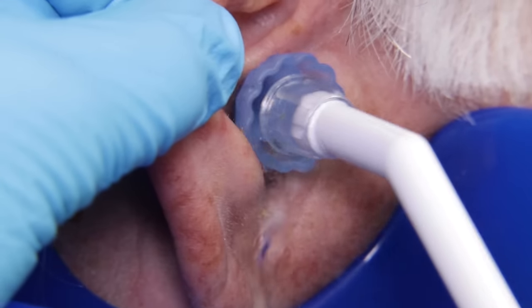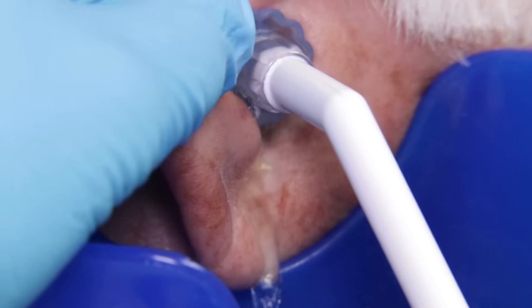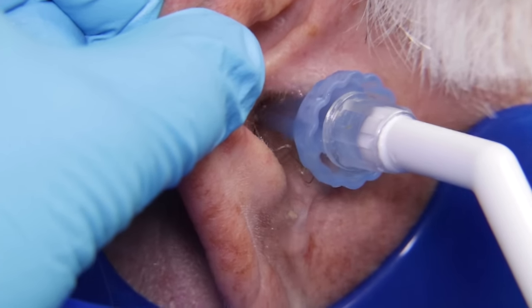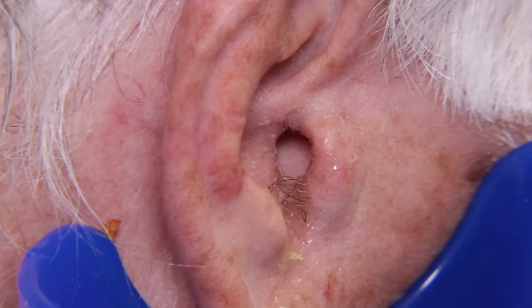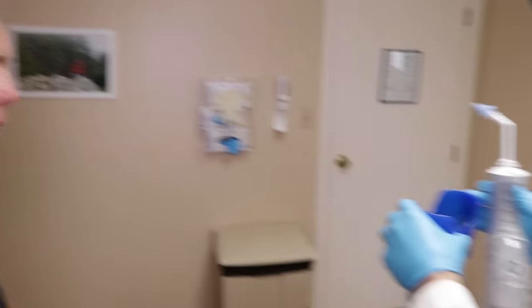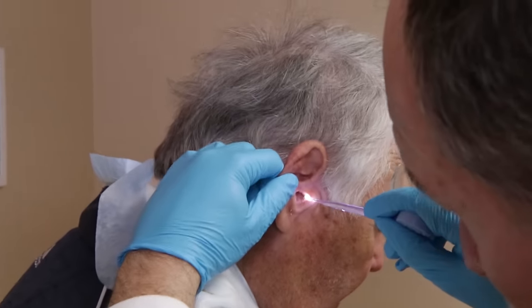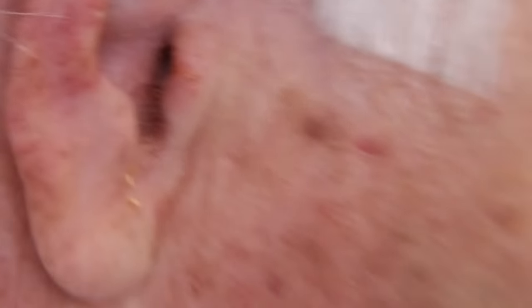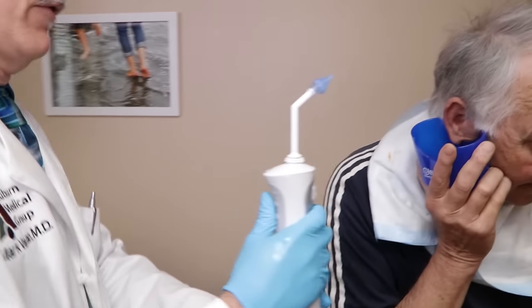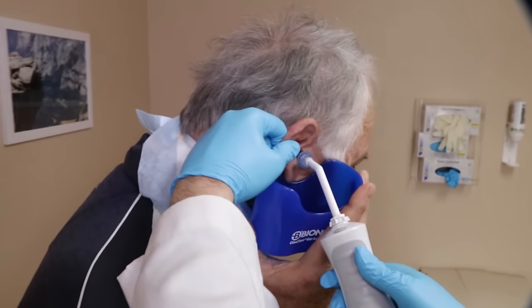There's some. Getting more, as you can see. But it's just soft. You feel it — so let's not do that. That hurts. Some people are going to suggest that we use the syringe instead of this, but really the syringe would take longer than this, from my experience.